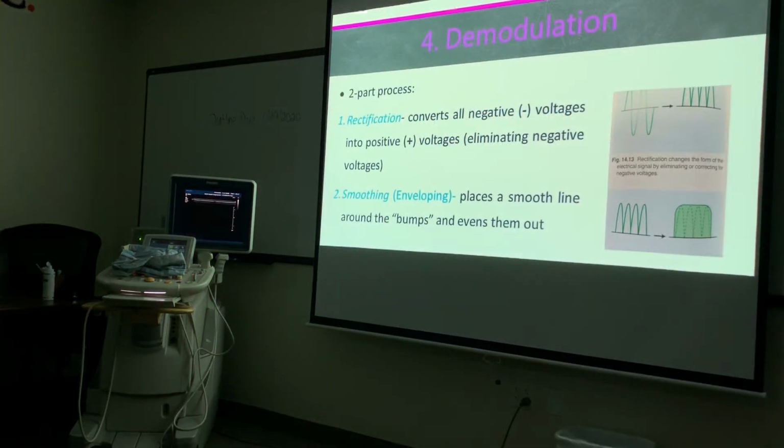Alright? Also a two-part process. Compression, demodulation, back-to-back receiver operations, two-part process. Okay? This is the picture out of the book. Sorry guys, I cut it off a little bit. I don't know when I took my picture, I guess it didn't apply to that part.